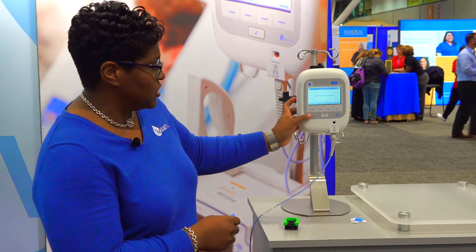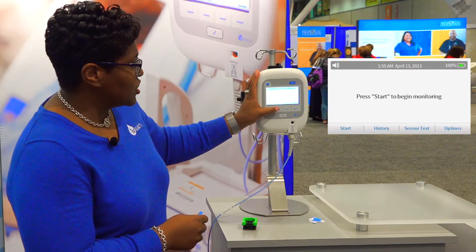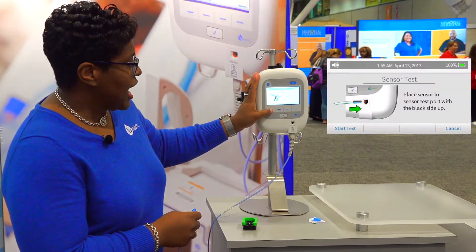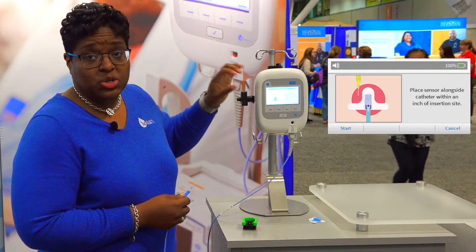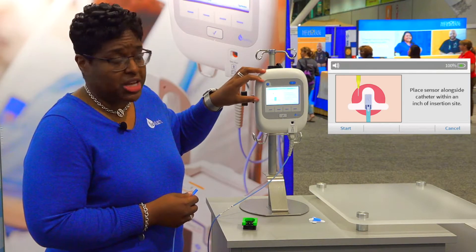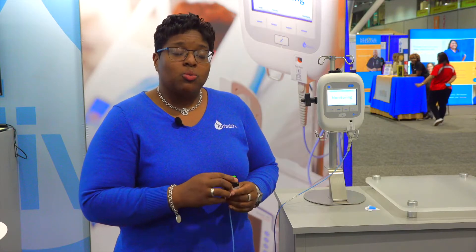Now we're going to set up a monitoring run. We start the system for a new patient and check to make sure everything is connected properly, then hit OK. There's a diagram showing exactly where the sensor cable and receptacle should be placed, and then we start monitoring. We'd like the system to run about 30 seconds to a minute before you start infusing — that sets a baseline for what the tissue normally looks like, and then the system monitors for any deviation from that normal state. If you're already infusing when you start the monitoring run, it will set its baseline from that point and monitor from there.